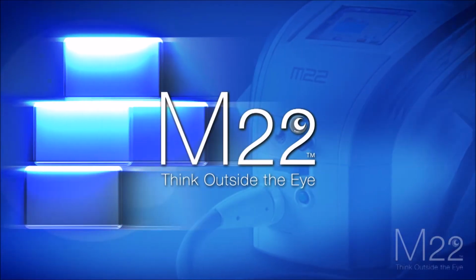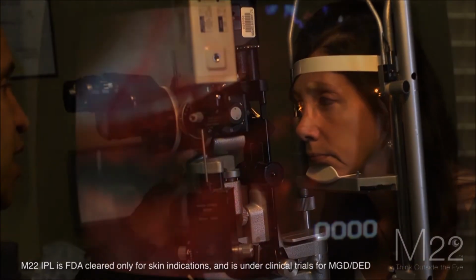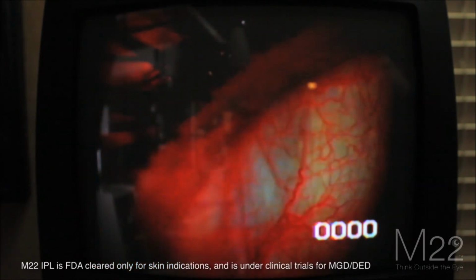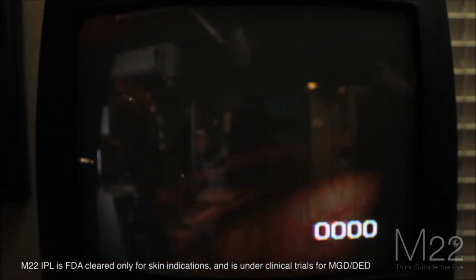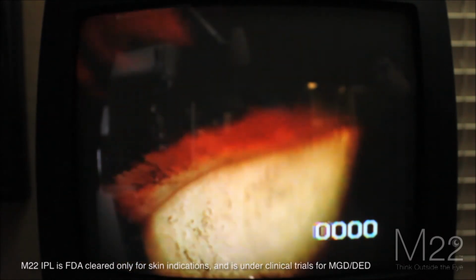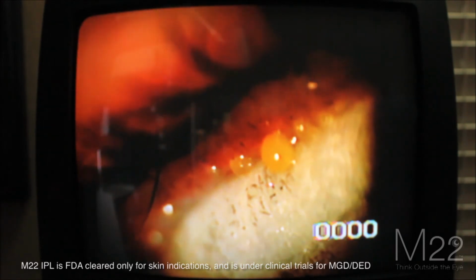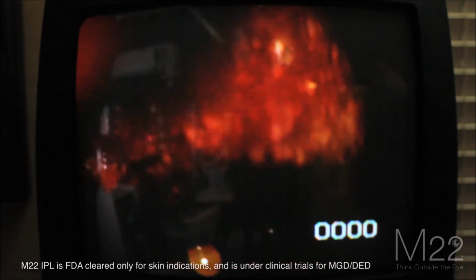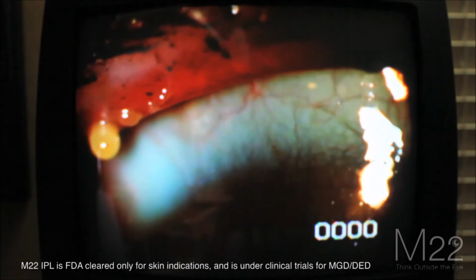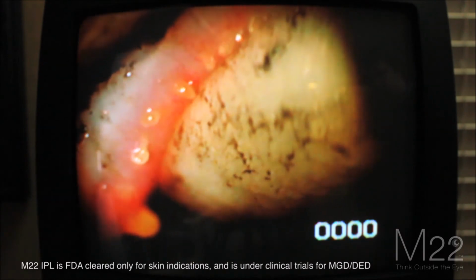All right, so we've just finished the IPL. Now we've brought the patient over to the slit lamp. And what we're going to do is we have the ability now to work on these blocked glands. Look up for me. And I just take a Q-tip, which I've already moistened. There are about 30 to 35 meibomian glands in each of the lids. Oh, can you see that on the TV screen? Mm-hmm. Yeah. So these glands are supposed to secrete an olive oil-like secretion. She's making a toothpaste-like secretion. So you can see that energy goes up to the upper lid and actually opens the upper lid so that you can do gland expression.